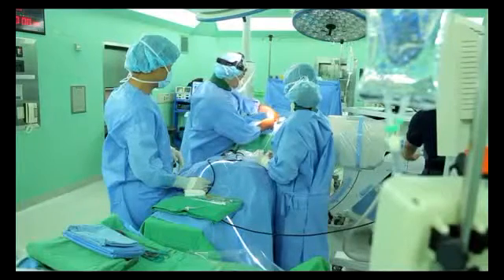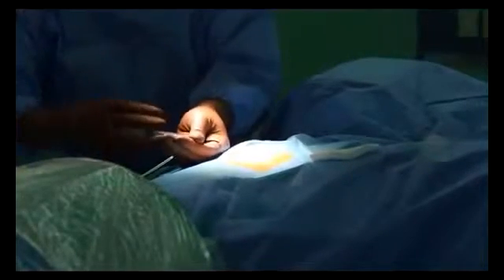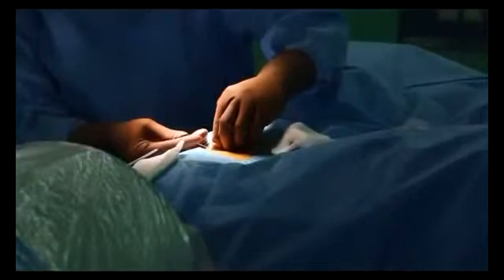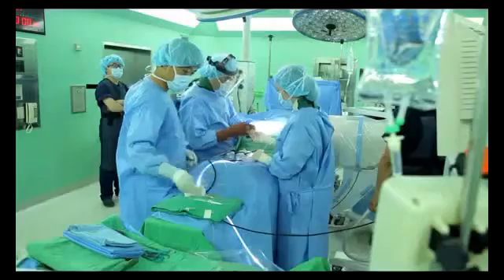Look for the appropriate place to puncture in the area of hiatus. Injection of the local anesthetic in the area of hiatus. An epidural needle is inserted into the epidural space of the spine through the hiatus above the coccyx. Place the guide wire into the hiatus through the needle.